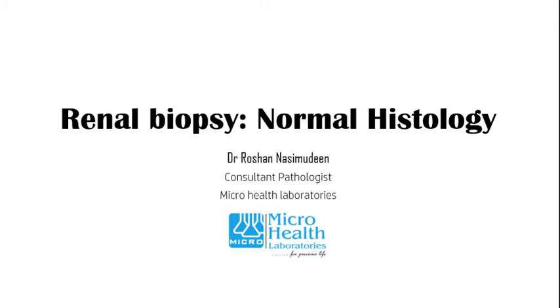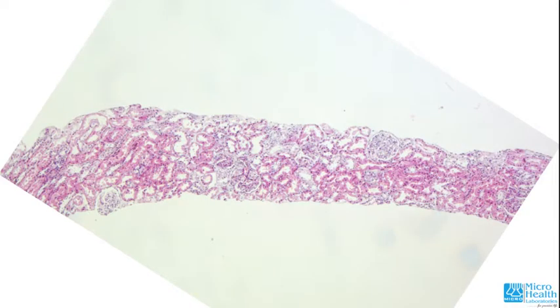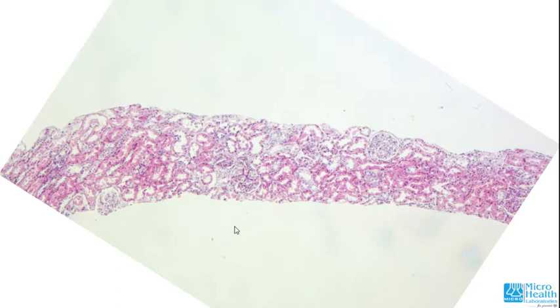Usually the cores are around 1.5 centimeters. At scanner power we can appreciate the globular structures — that is the glomeruli — and the pinkish color of the proximal convoluted tubule, which appears very eosinophilic in H&E stain. The PAS stain gives a much darker, magenta-like color and stains the basement membranes very well, as does the silver stain like JMS.